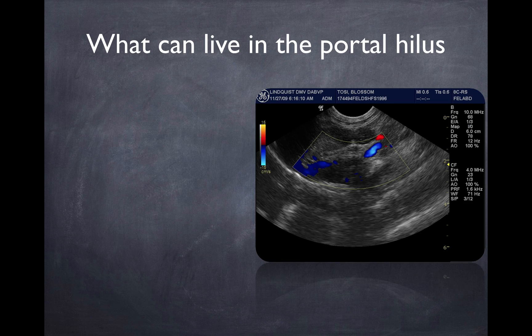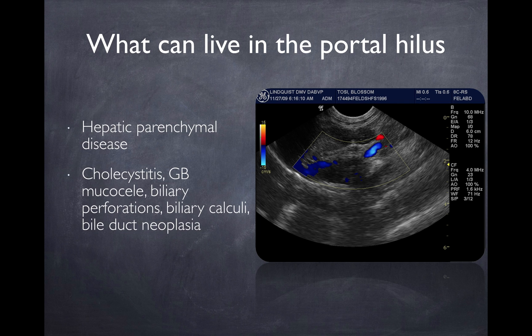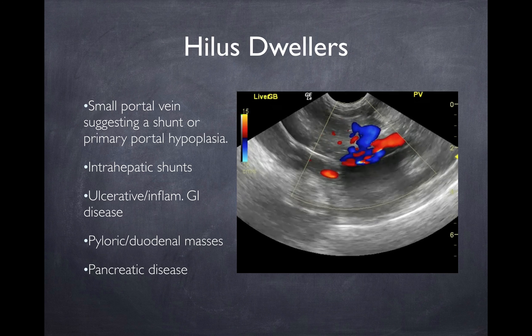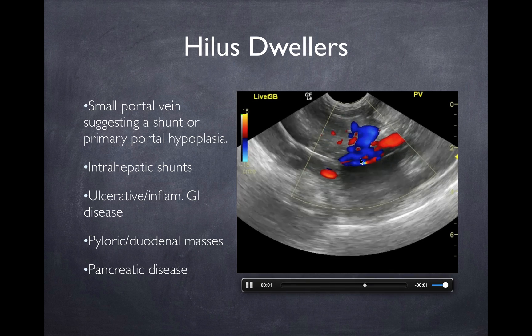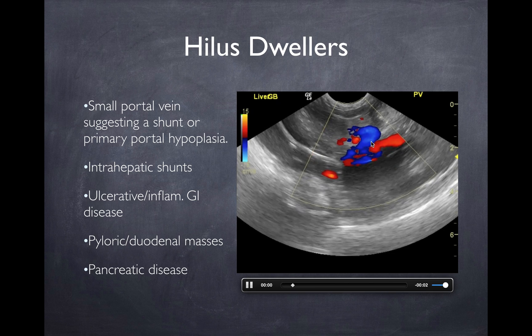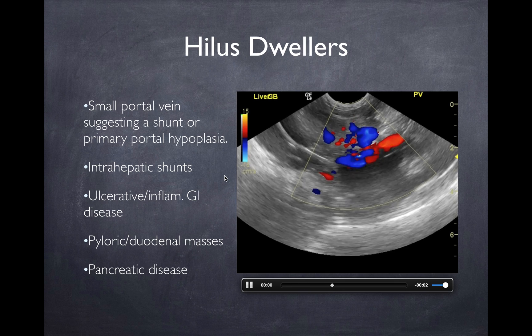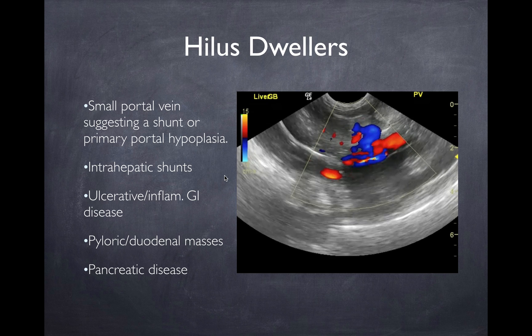It's important to evaluate the portal hilus and see what's going on in there. A lot of people don't get into the portal hilus sonographically, and if you're not doing that you're going to miss a lot of pathology. In the portal hilus you can also diagnose shunts — this is a typical extrahepatic splenocaval shunt, and you can see it as a blue vessel in the position between the portal vein and the vena cava. I hope that helps clear up some common bile duct anatomy and the necessity to get up into the portal hilus to evaluate what's going on.